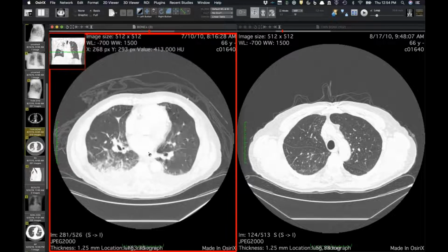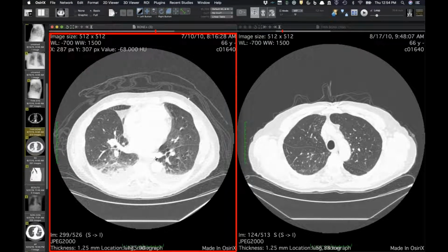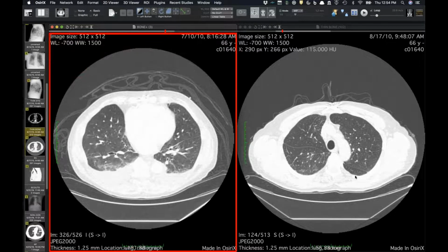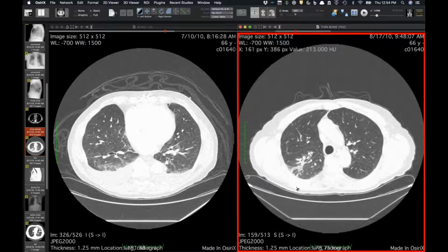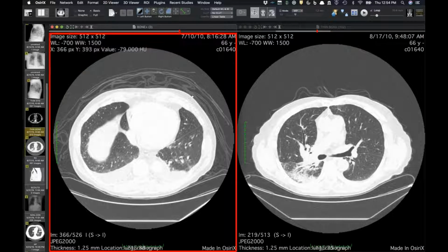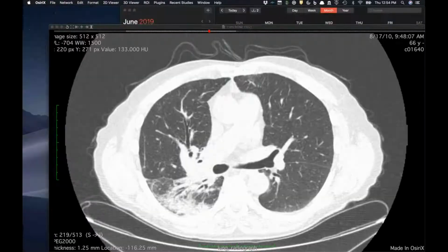And that may provide extra mobility, at least in the case that you're showing. It looks like the fissure is pretty complete. Okay, so you are still on there listening. I'm still here. Our guy never had surgery or anything. It just was a spontaneous torsion after an infection. It's also been reported spontaneously with masses, with pleural effusions, pneumothoraces, something that allows the lung to rotate.